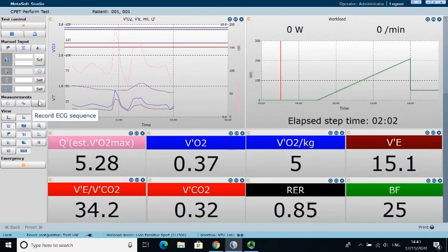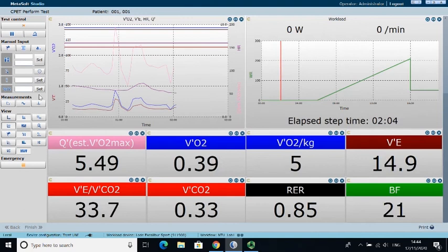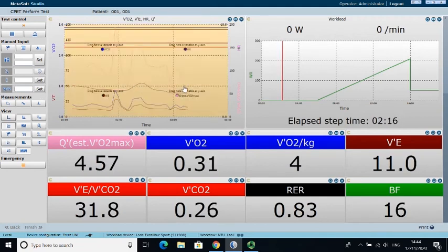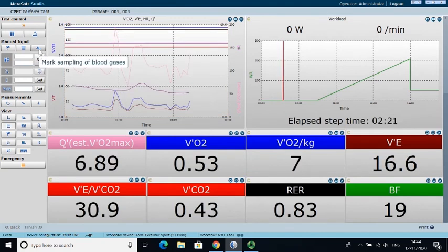There are different measurements that you can take. You can get it to record ECG if you've got the correct hardware. You can get it to do flow volume loops if you're interested in respiratory mechanics. There's loads of different bits and pieces, and the more you get into the software, the more you explore, I suppose, but we don't need most of these things.